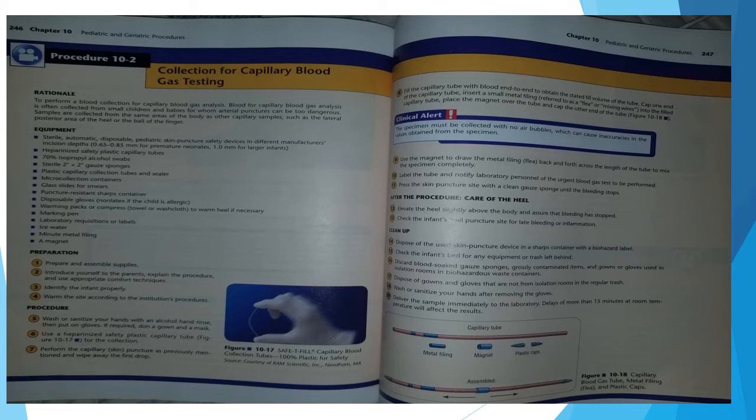Preparation. Prepare the assembled supplies. Introduce yourself to the parents, explain the procedure, and use appropriate comfort techniques. Identify the infant properly. Warm the site according to the institution's procedures. Wash or sanitize your hands with the alcohol hand rinse, then put on gloves. If required, put on a gown and a mask.